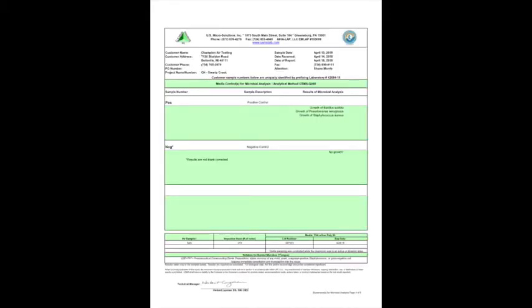The following page is going to be the identification page. This is the list of the organisms that were found to be growing on your samples, and they're going to identify the name as well as a possible source, whether it's soil, water, or human skin. This is good information to know when we're trying to have remedial actions as far as the cleaning of the area.